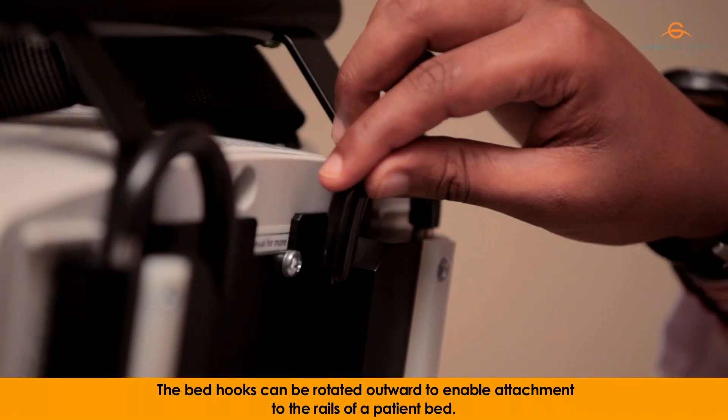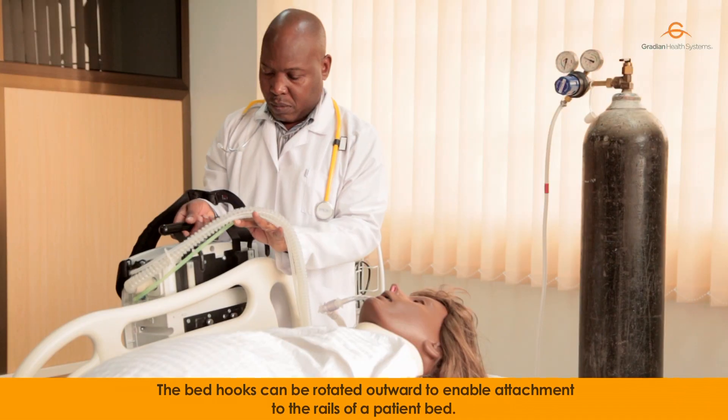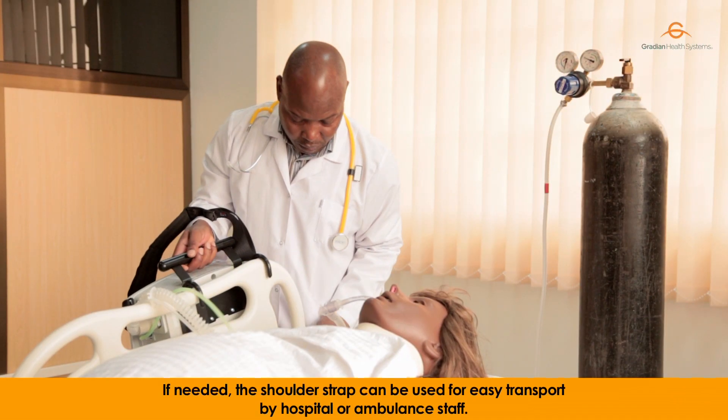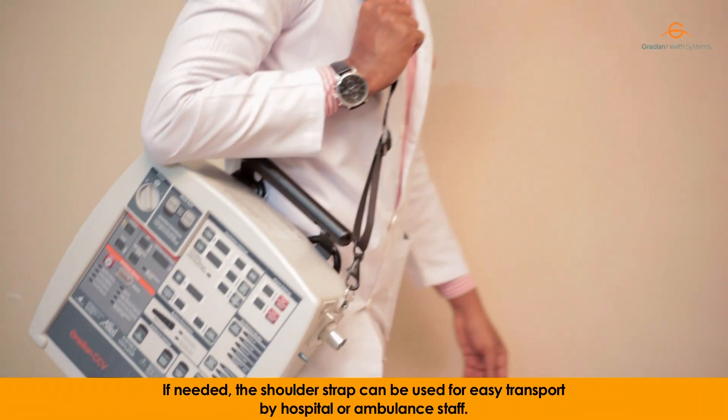The bed hooks can be rotated outward to enable attachment to the rails of a patient bed. If needed, the shoulder strap can be used for easy transport by hospital or ambulance staff.